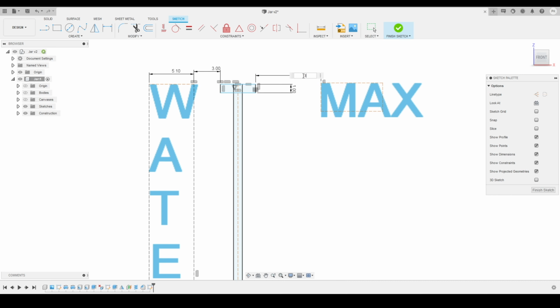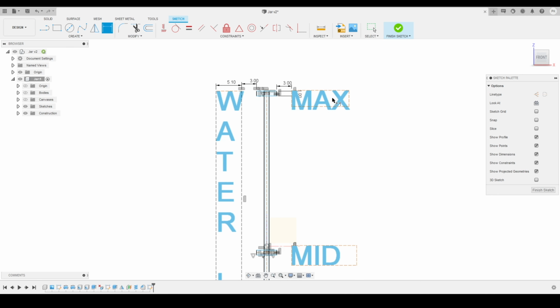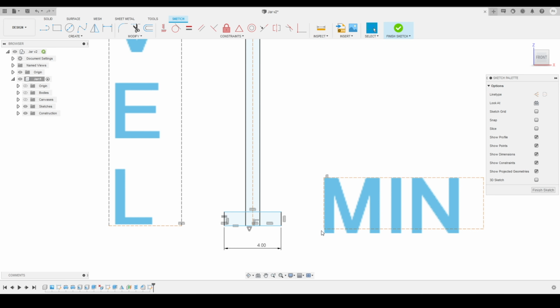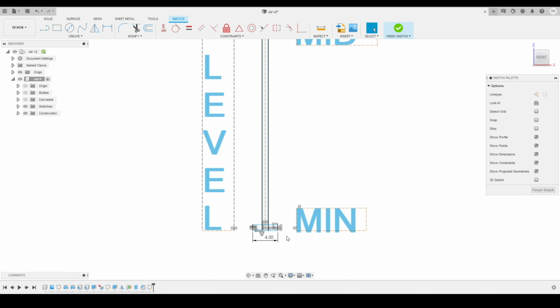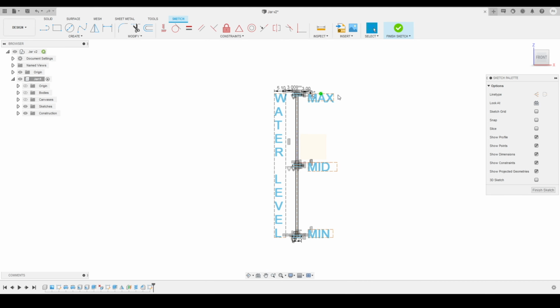Here you can see, and we'll press enter. So all three texts are now just 3 millimeters on both sides, like the water label and the max, mid and minimum text. Both are equally distributed on both sides. So what I can do now is, for the bottom, I will make sure that they are also constrained towards the bottom, and for the top also I will apply the constraint, so they will be on the same level, so the text will look more uniform on our body.